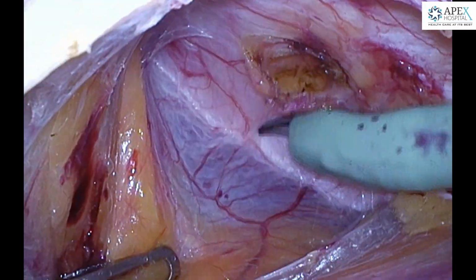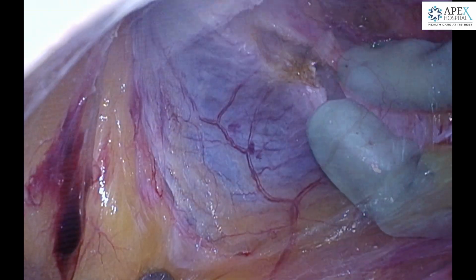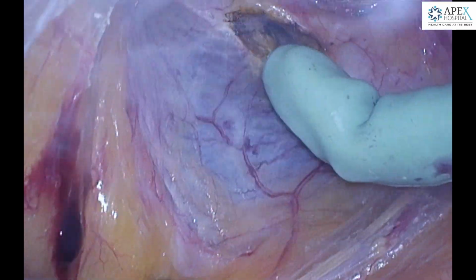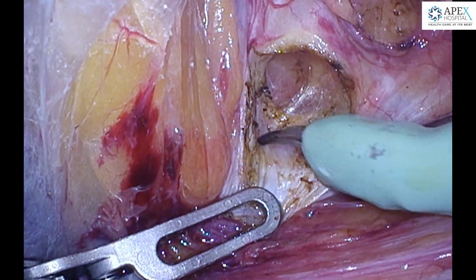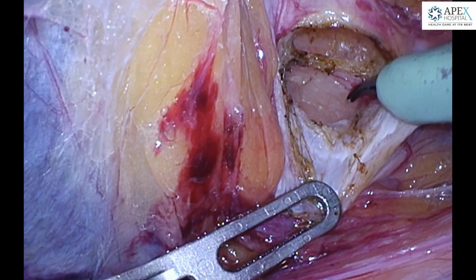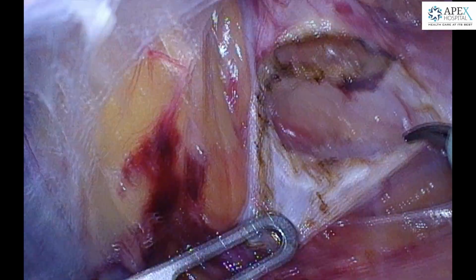Therefore, further lateral dissection is done and a second opening is made, which is barely at the margin of the right rectus muscle, and therefore there are two inadvertent injuries to the linea alba in this case in the upper part, which we will need to repair at the end of the procedure.